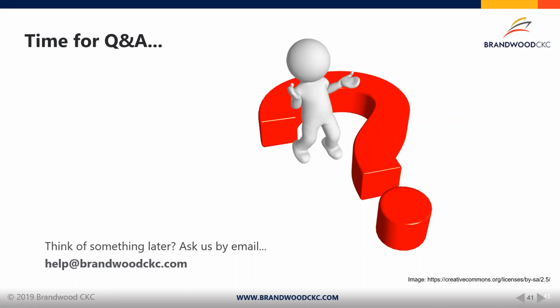One of the questions that we received, and potentially 2 are interrelated or talk to similar points: how are cloud-based web servers and normative databases dealt with, and how are predictive classification algorithms treated? Or what about AI and machine learning impact? So I guess, and we'll run this as a bit of a conversation with Yervant, it's first of all difficult to answer in general terms, as it will all depend on the type of data that your software is generating, obviously the intended user of that data, and the context of the use, but the key is whether or not it can influence or support the medical care.